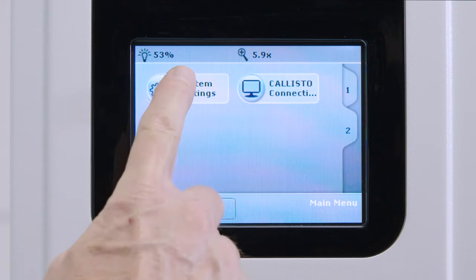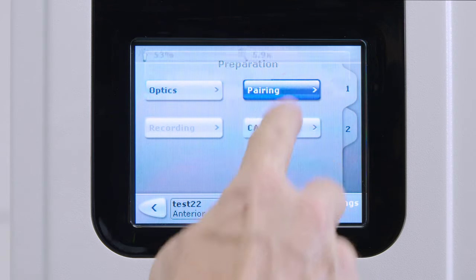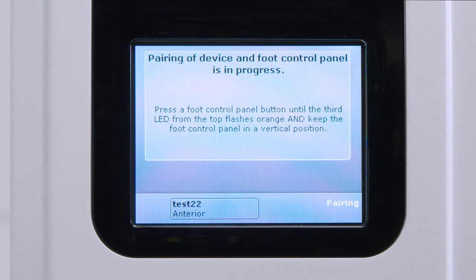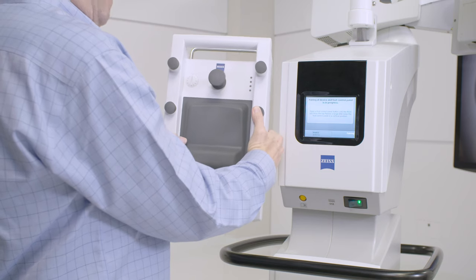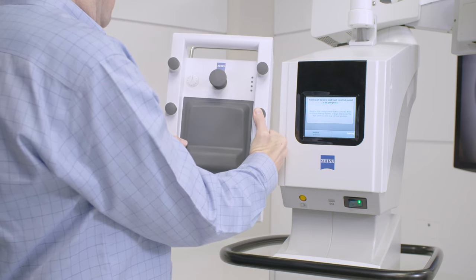For both systems, now select the System Settings icon. Once in System Settings, select the Pairing icon. Then select Start Pairing. On the Wireless Foot Control Panel, hold down any button until the third LED light from the top starts blinking.